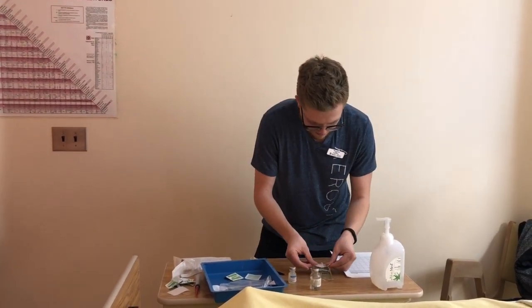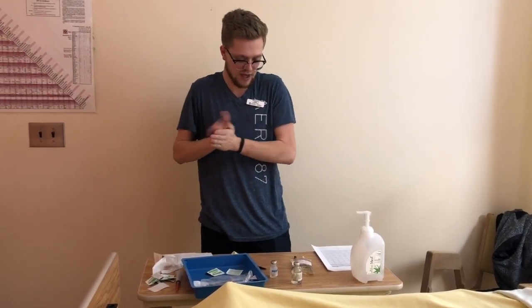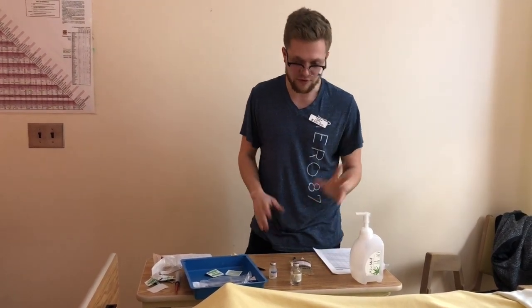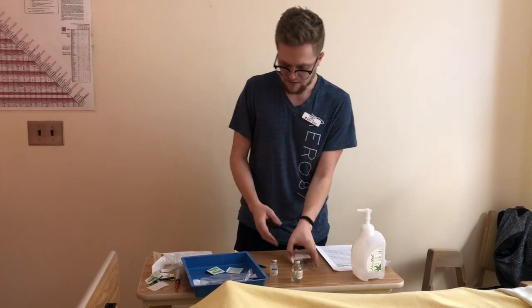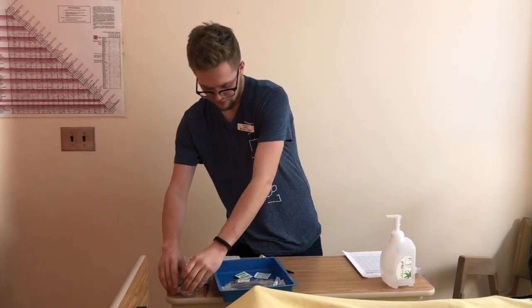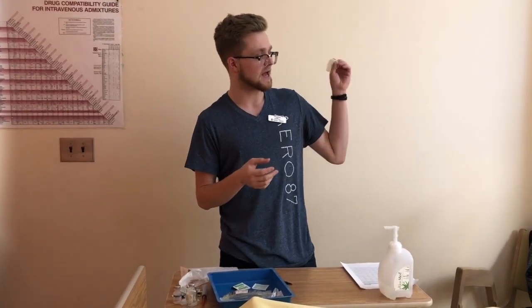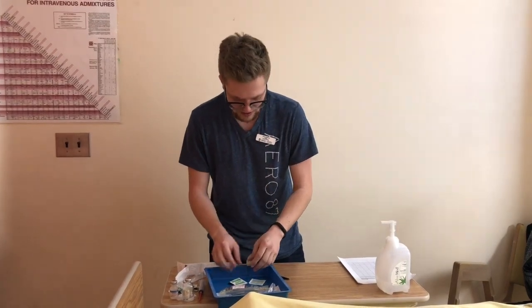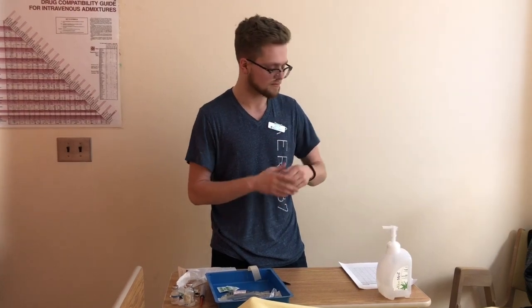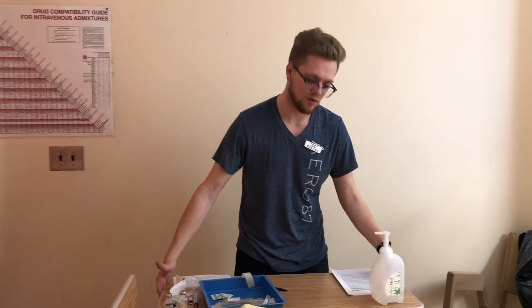Put that on there. All right, and so now we are ready to head into the patient's room and actually hook all this up. So we want to make sure that we have everything. So I'm going to have the MAR with me again for the third med check. I'm going to have the mini bag itself, our secondary tubing kit. These I would leave in the med room, but I might use it for my third med check today. And I also have this, which is going to be my tag for the secondary line of tubing, as well as a few more of these, which I will be using for the IV site in a minute, or the connection site. Other than that, I think we're ready to head into the patient's room.